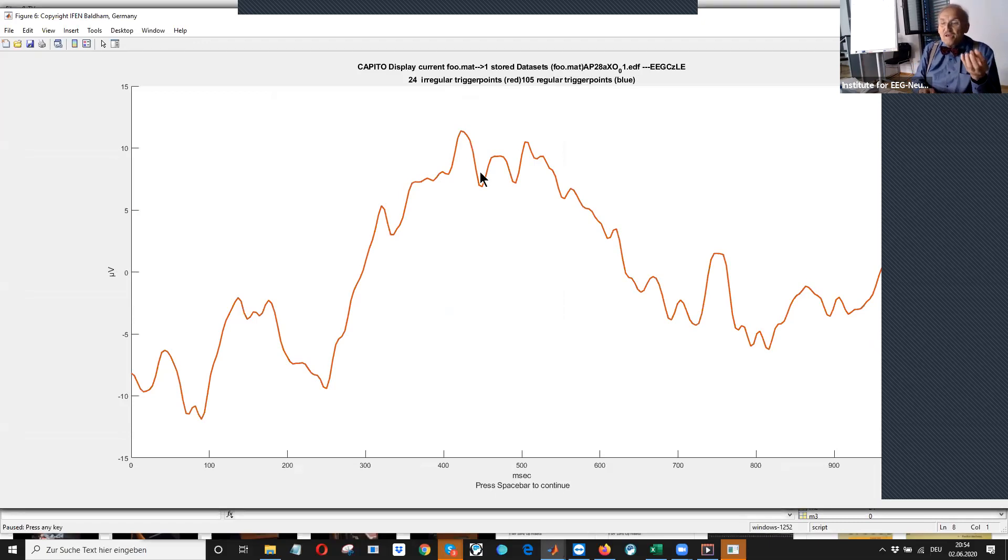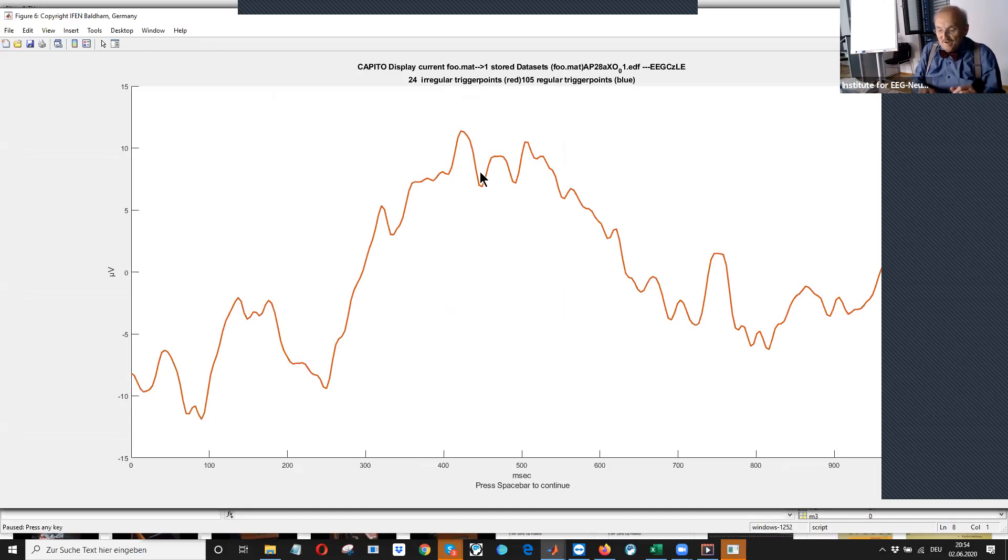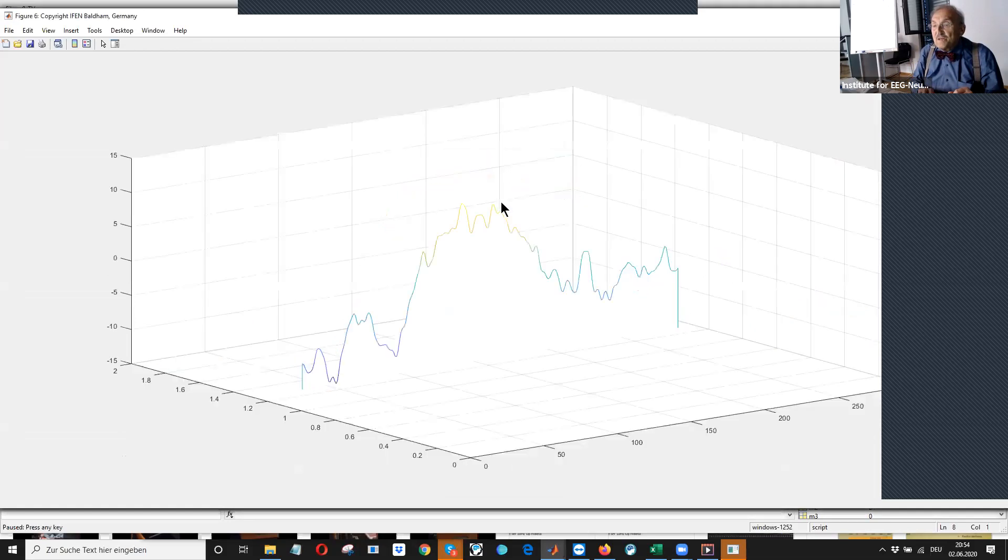Then we get an even clearer picture. And also we can see whether this P300 is reproducible. Yeah. Now we have stored it.